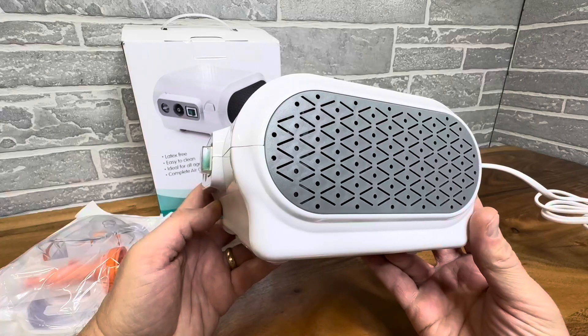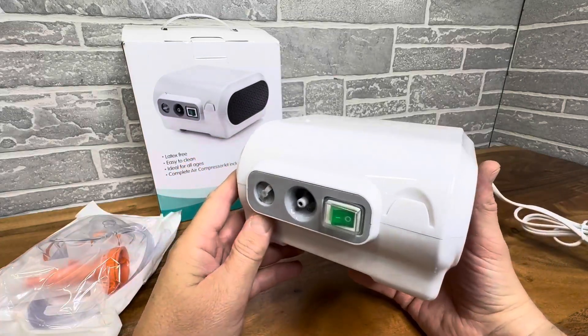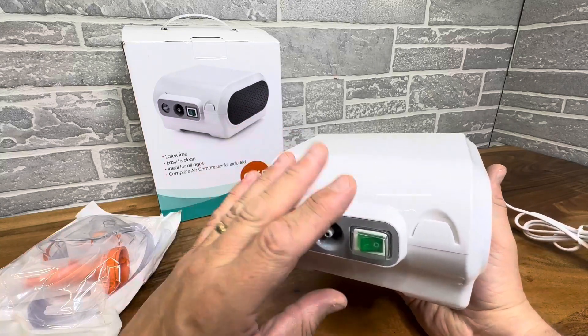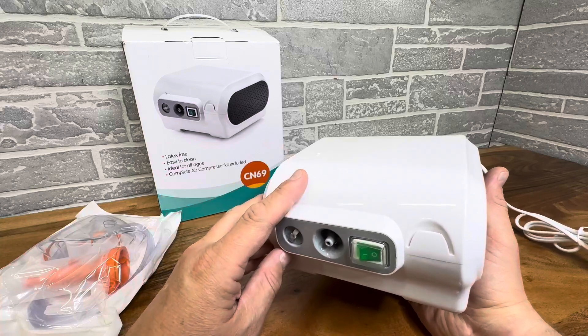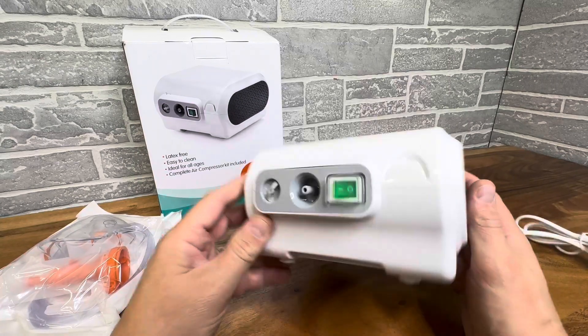It's not super quiet, but it is not unpleasant. It does have to pump air so it's going to make some noise. But it's very easy to clean, ideal for all ages, and it's latex-free, so that's really nice. It's your complete air compressor nebulizer kit.